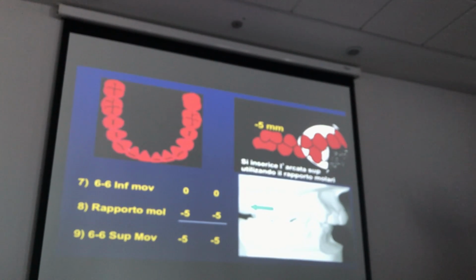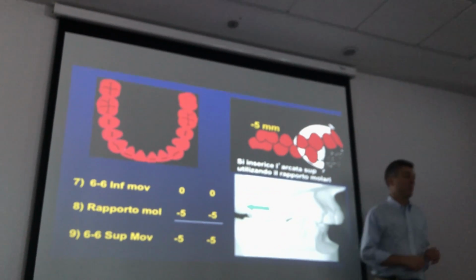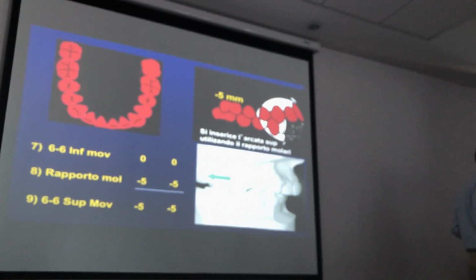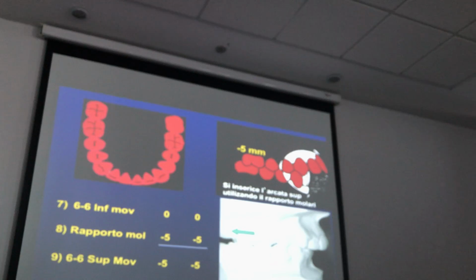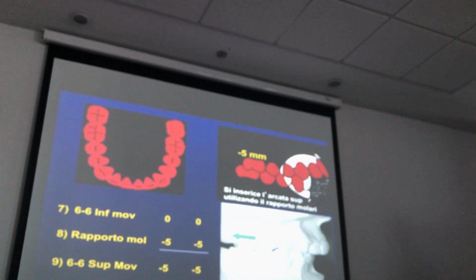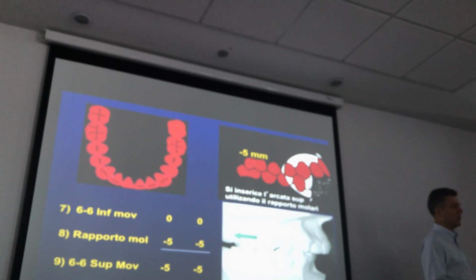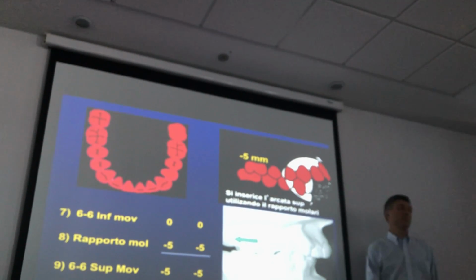Consider that the indication of the upper arch is only the upper molar. You could distalize every time the 6 molar, the first molar, the superior, when it is in the second class. It's not really important what you do, because once you know what you're doing, you can even decide to extract the first premolar.